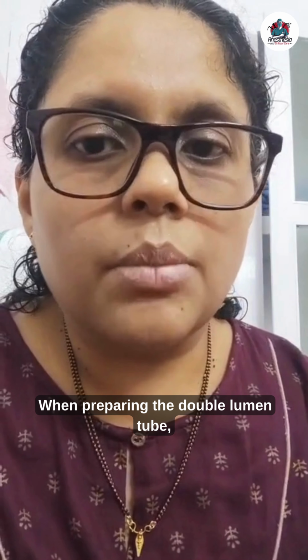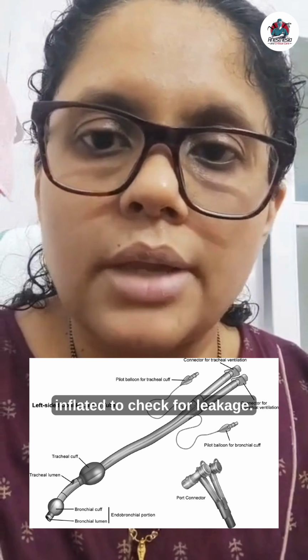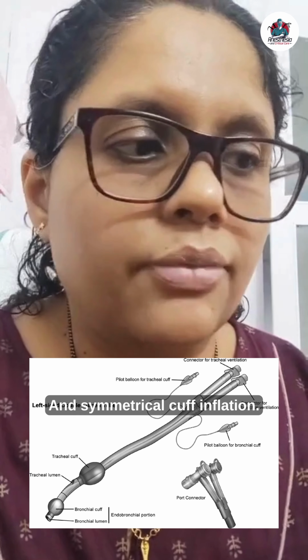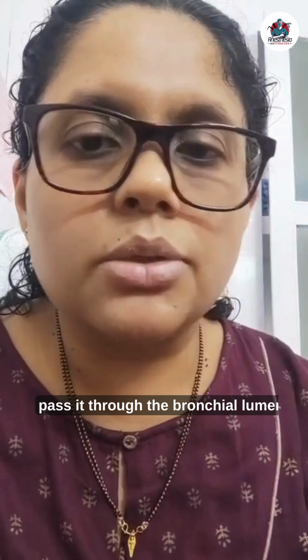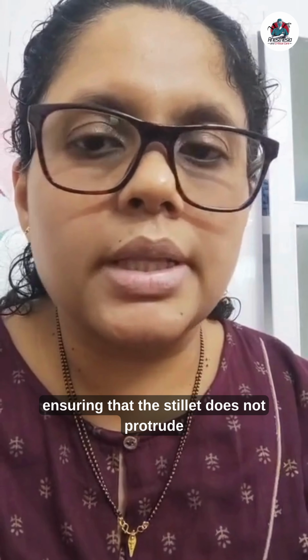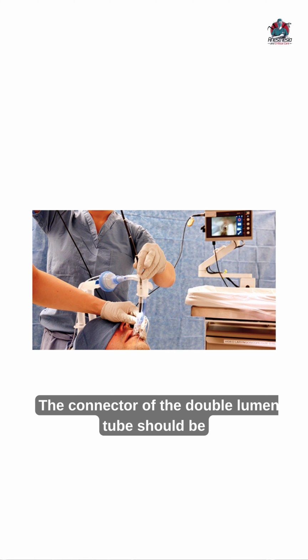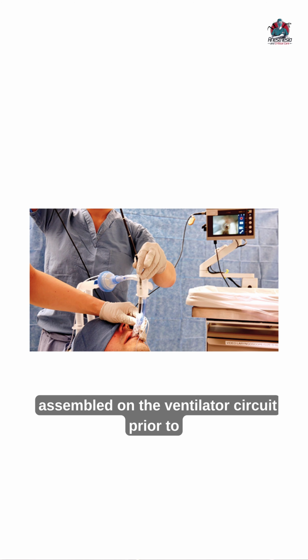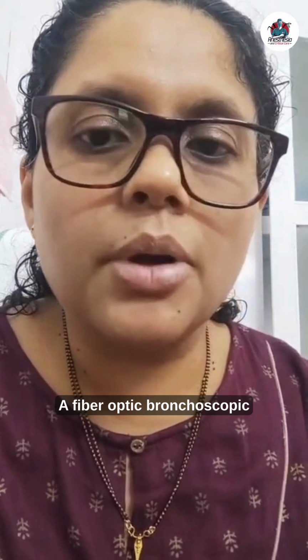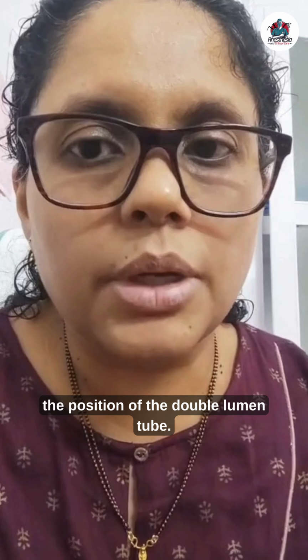Preparation and technique of insertion. When preparing the double lumen tube, both the tracheal and the bronchial cuffs should be inflated to check for leaks and symmetrical cuff inflation. Apply jelly to the stylet and pass it through the bronchial lumen, ensuring that the stylet does not protrude out of the bronchial lumen. The connector of the double lumen tube should be assembled on the ventilator circuit prior to intubation. A fiber optic bronchoscope should be available to confirm the position of the double lumen tube. This is the gold standard technique of confirmation.